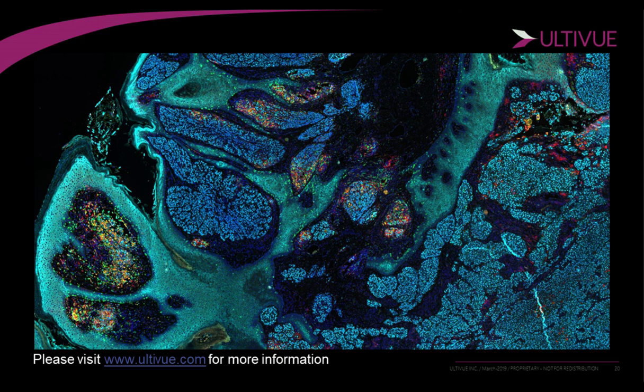We do have software that does our co-registration of re-imaging the same slide and then aligning those specific images. As far as the systems or image file types that we can take, we're pretty flexible. Like I said before, we can work with the AxioScan, the Versa, the Zeiss to do these types of stackings.